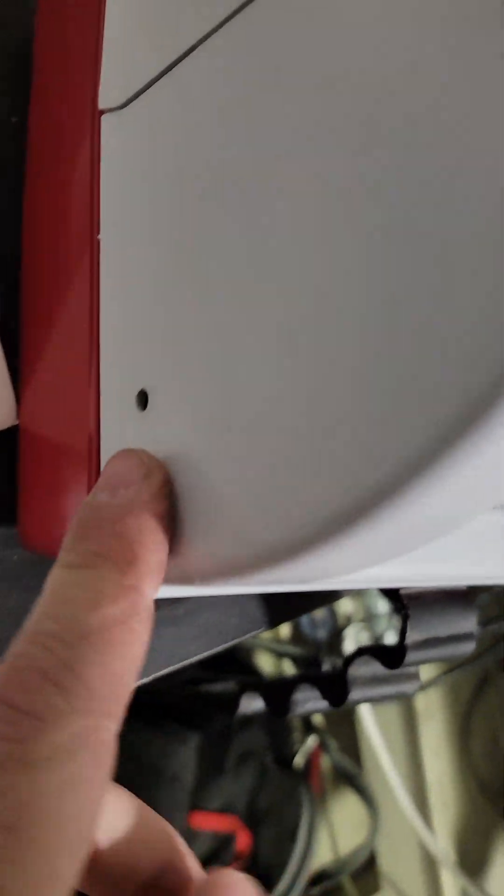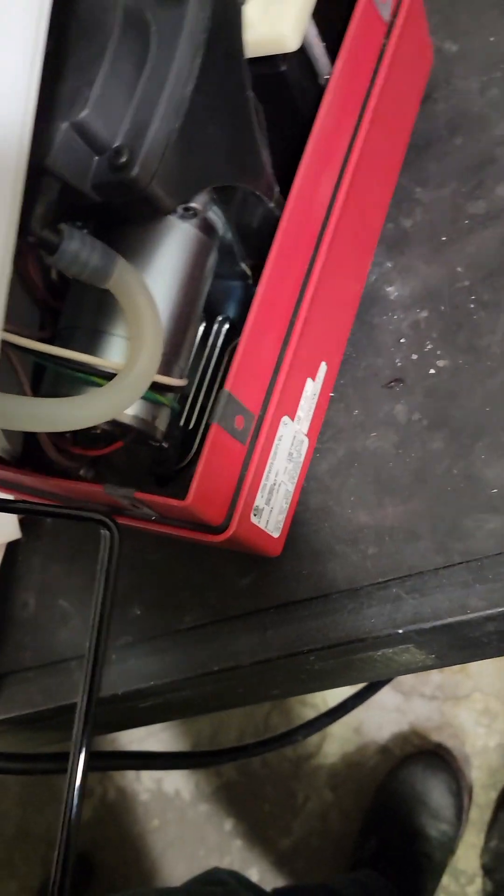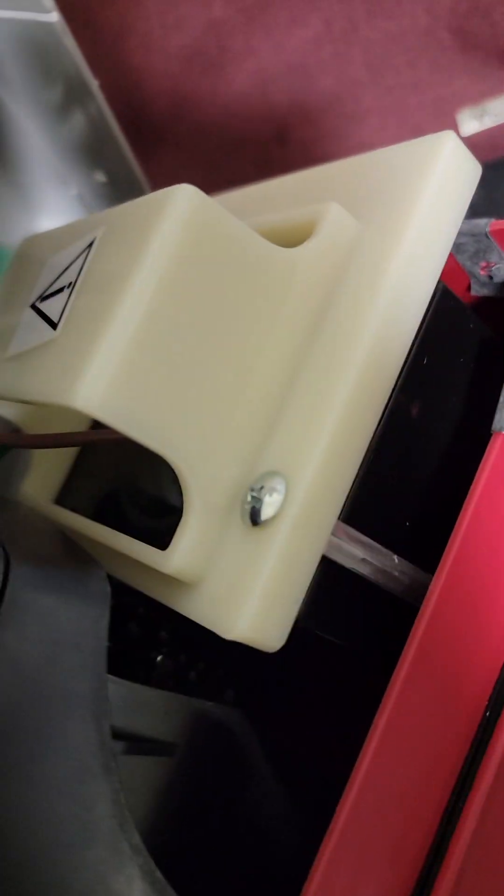Easy enough. Pull one, two, three, four, five, six screws with a small screwdriver, pry it, get the top off, and there's your battery.